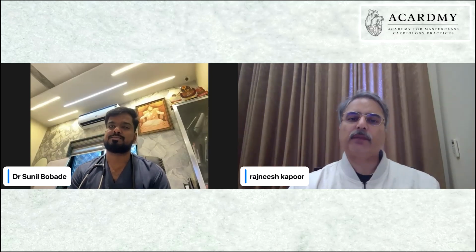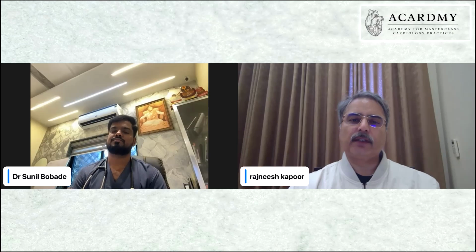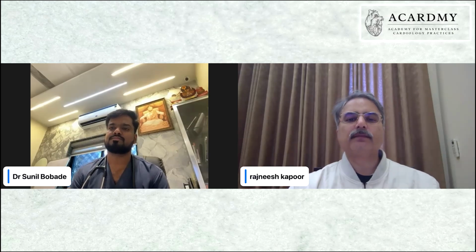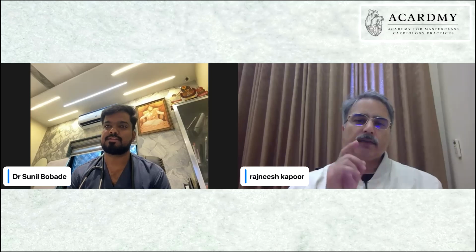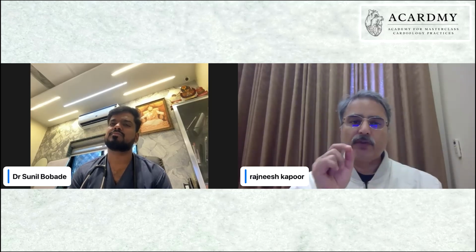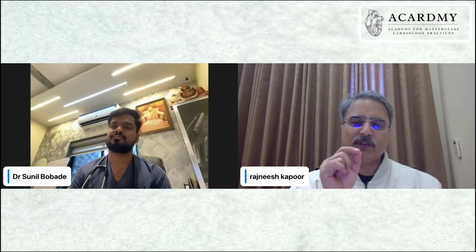Okay, we'll have a word from Karan and then I think we can go ahead. Karan? Yes, sir. Sir, you correctly emphasized that the Gaia wire is a great wire. One more important thing about Gaia is that there is 1:1 torqueability. The minute you torque a little, it torques as much as you want. That's why it is a great CTO wire, sir. Very well done case, sir. Gaia is one wire which remains totally in your control. Yes, sir. The control is with you. It's not there in Conquest.